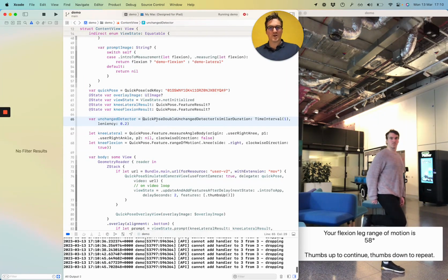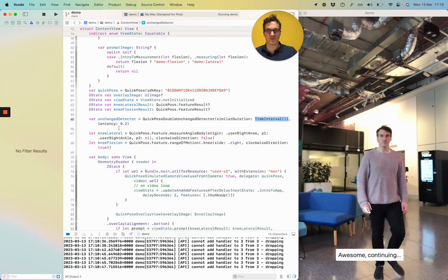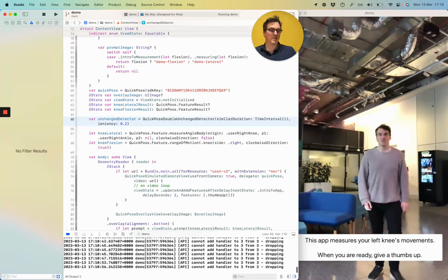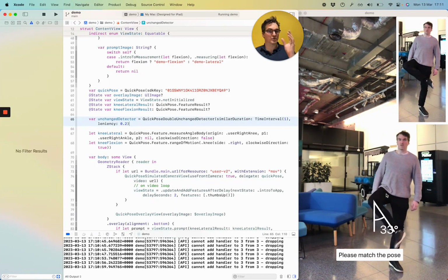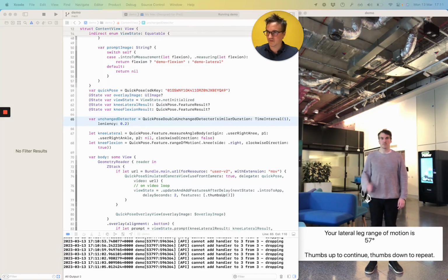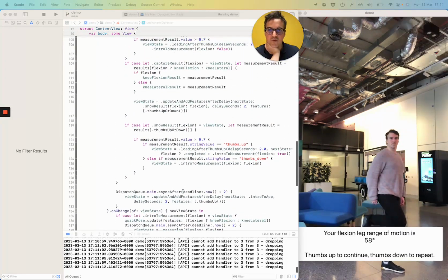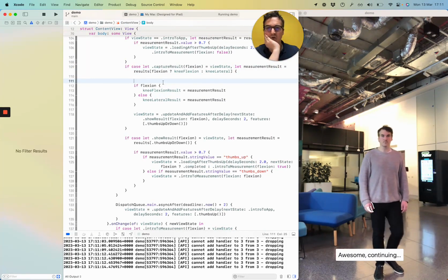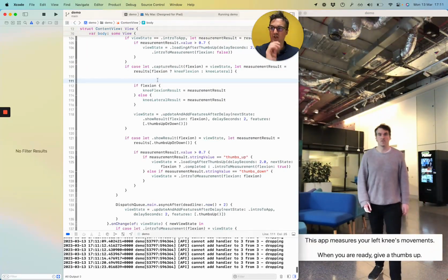So I'm going to say here that if a double is unchanged for a time interval of about a second, with a leniency of 20%. Now, leniency, say for example with an angle, the smaller the leniency, the more strict it is. So I'm just going to reference my old code. Down here in the capture results section, we want this to be a bit more restrictive now, and we only want it to change when the unchanged detector has changed with it.